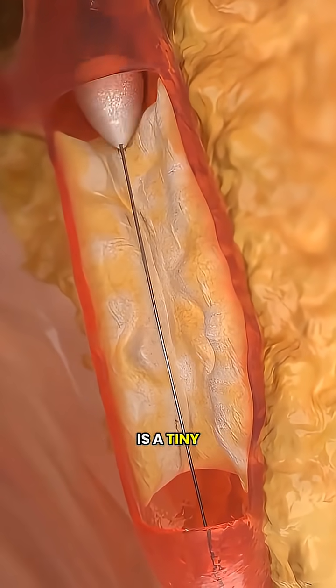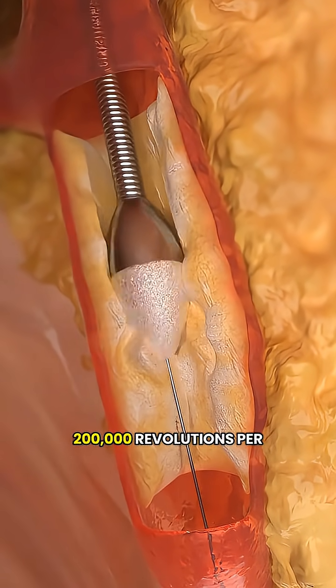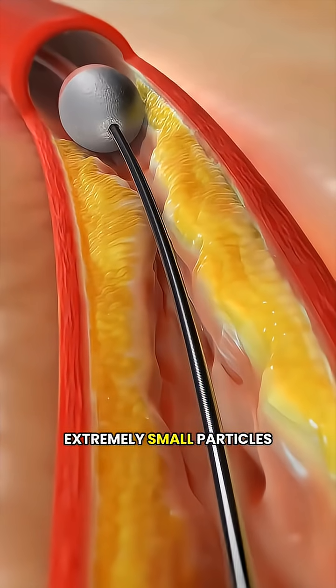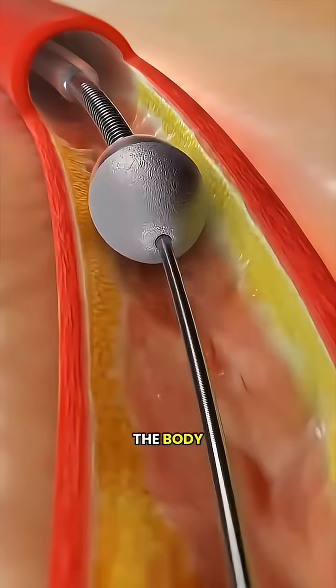At the tip of the catheter is a tiny diamond-coated rotating burr that spins at nearly 200,000 revolutions per minute. It grinds the hardened calcium into extremely small particles, which then move along with the bloodstream and are gradually cleared by the body.